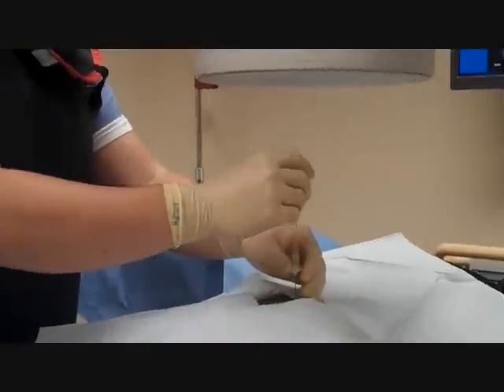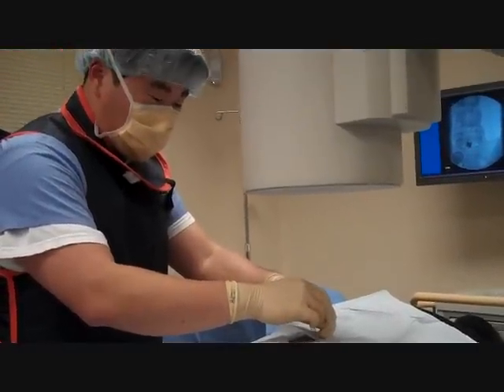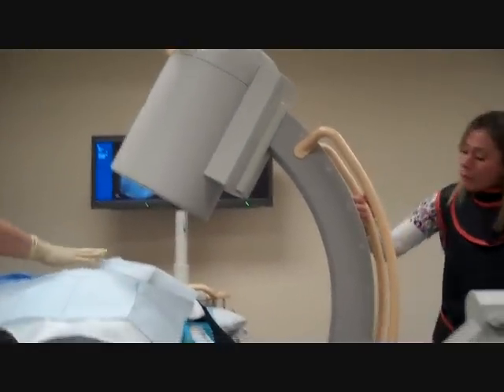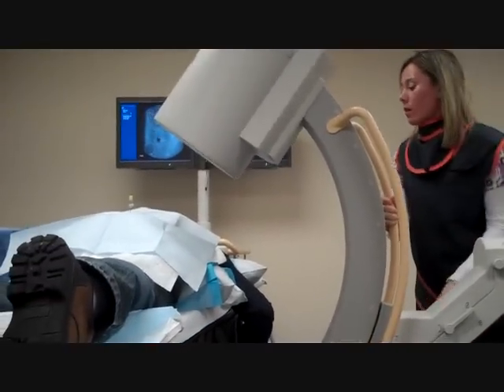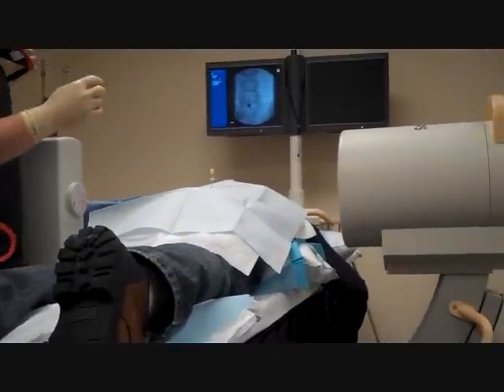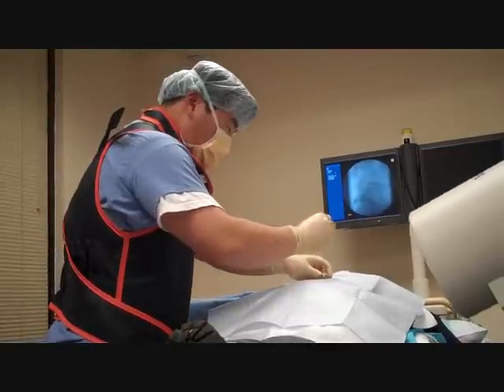I'm going to ask our radiology tech to get me a lateral view, please. As you can see, the patient's doing fine, he's comfortable — just confirming our position.